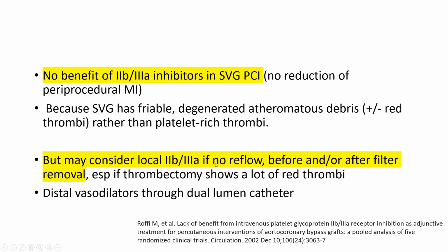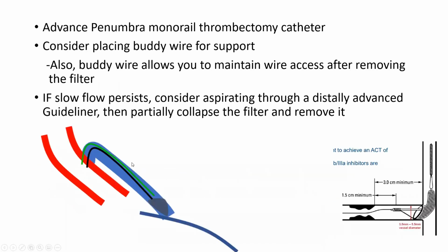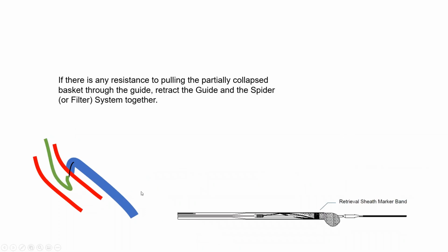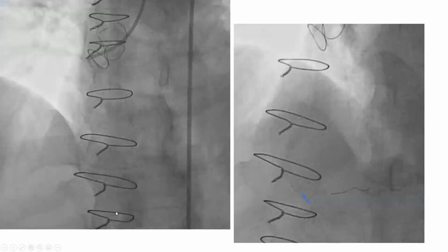However, you may consider local 2B3A through a distal catheter if you have no reflow before and/or after filter removal, especially if when you do thrombectomy in those sluggish flow cases, the thrombectomy shows you a lot of red material, which are red thrombi. Also, you should consider distal vasodilators delivered distally through a dual lumen catheter in those slow flow cases.